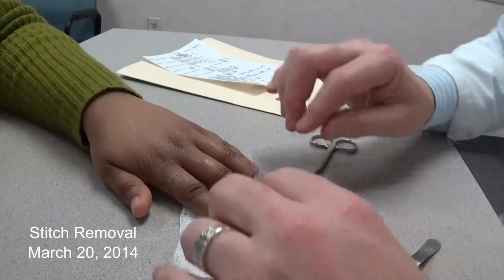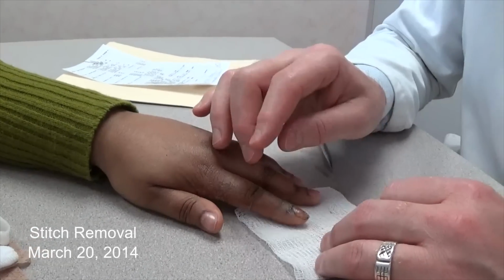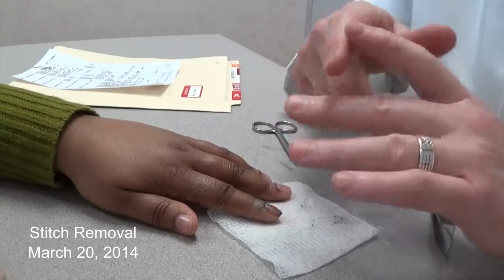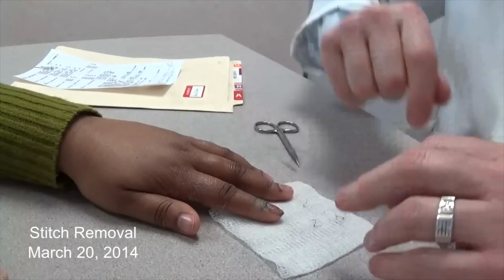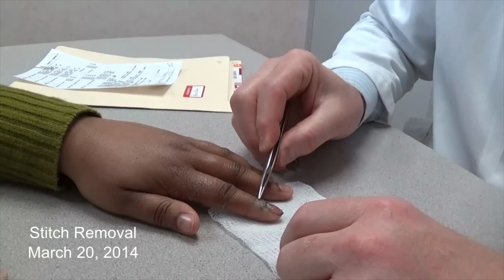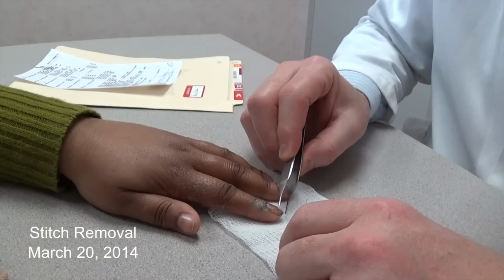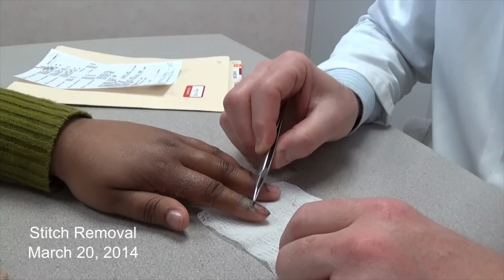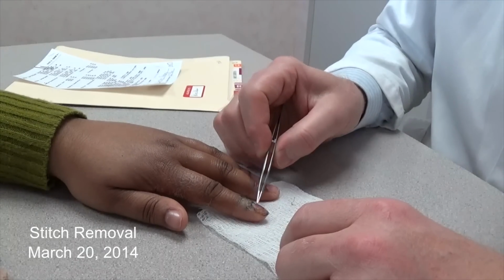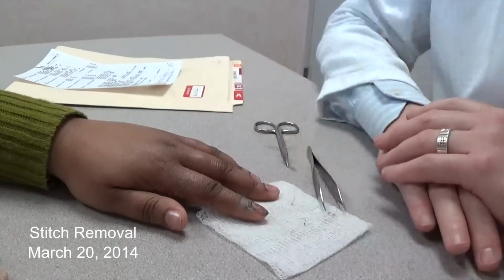Good. So what'll happen is, as you're bathing or something like that, this will kind of get loose a little bit. And it does. You remember, it's already been pulled out, so you can pull it out if it's kind of dangling. Just pull it out. It shouldn't even bleed. It goes about this far back. If it loosens when you pull it out, that piece that goes all the way to here will slide out. The reason we put it back in is so that it keeps that little fold and everything together and structured till it comes out.